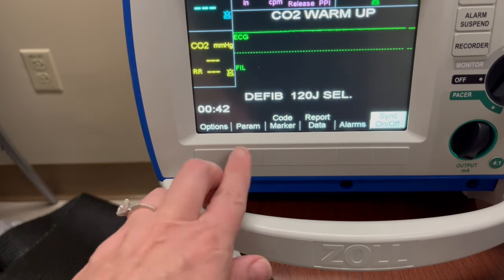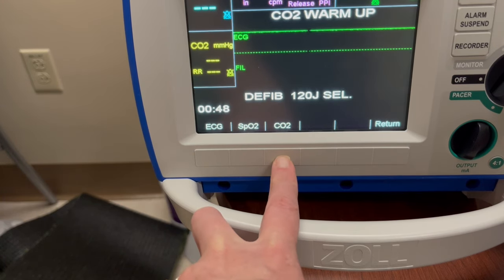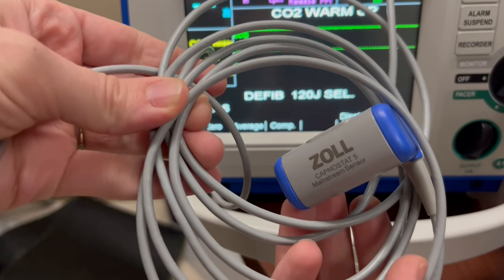Now let's go over the soft keys on the bottom. Under Parameter, you can change the parameter of the EKG, the SpO2, and the CO2. This is also where you can zero the end-tidal CO2 monitor if needed. The CO2 monitor is the cord attached to the back of the monitor.